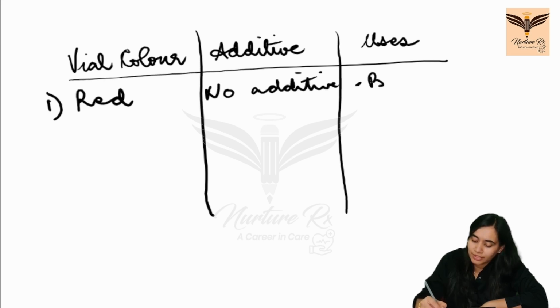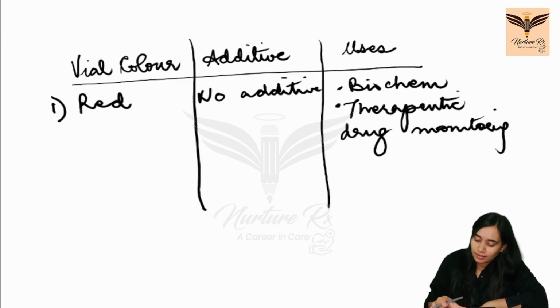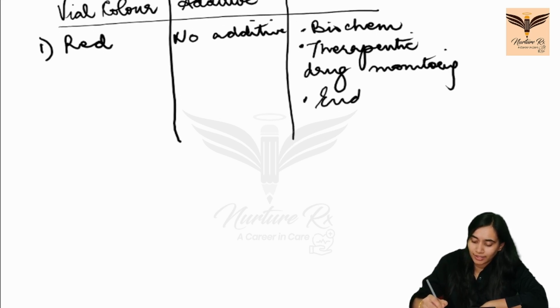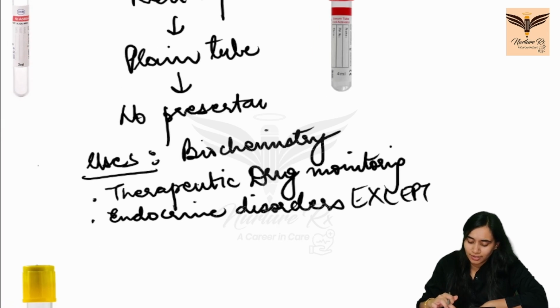Uses, we have seen biochemistry tests, therapeutic drug monitoring, and endocrine tests. Also, vitamin D is tested in this. Okay. Now, coming to the next.